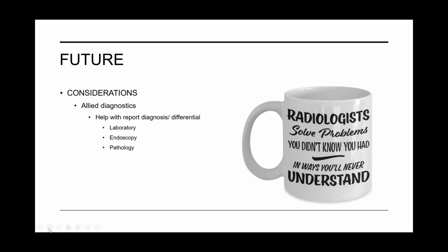That would lead you certainly on to your labs, pathology and endoscopy, for example, all rich stores of critical information in some cases, especially when you're maybe interpreting a CT colon and they haven't quite put where the lesion was that they wanted you to check. So again, just having that full integration within one platform would be of a benefit.